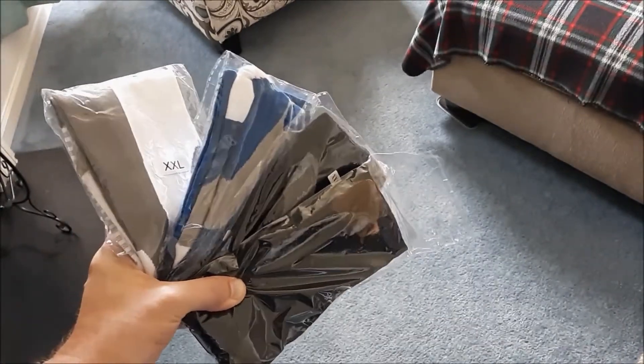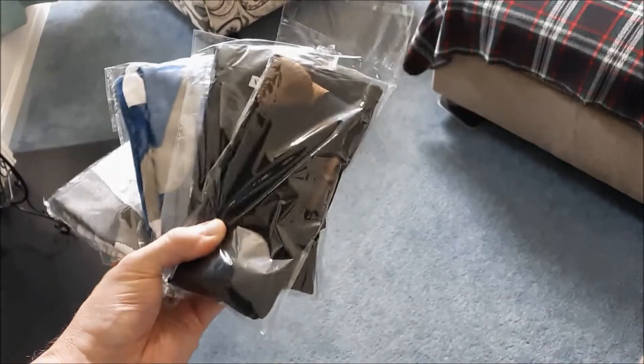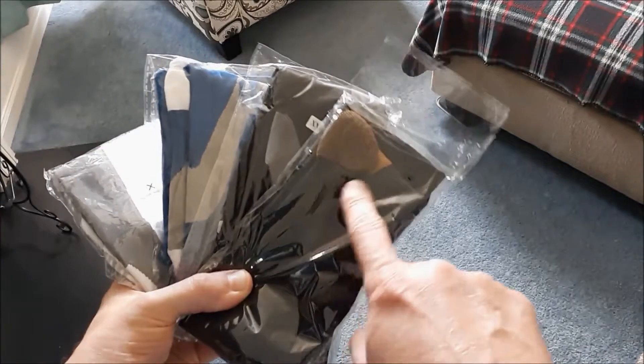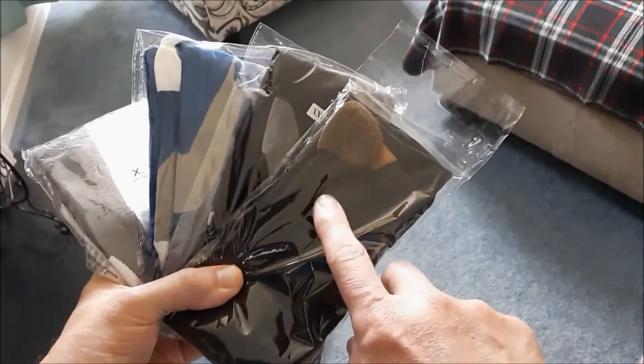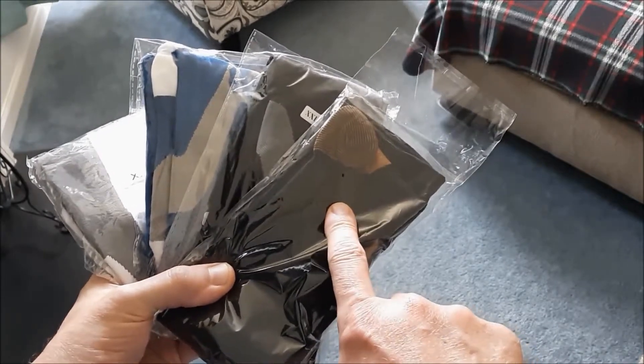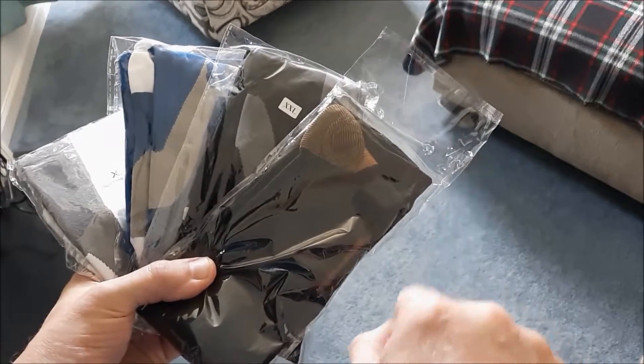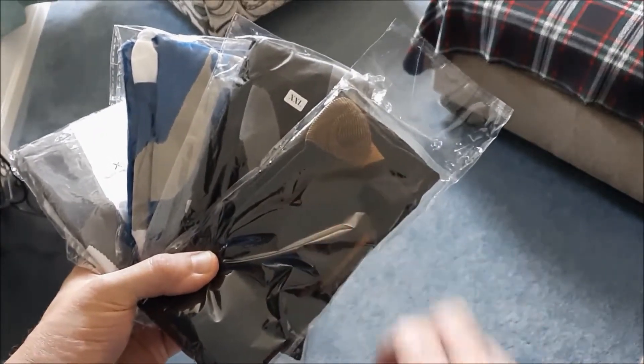They've got different colors — black and gray, blue and gray, white and gray, standard black with a copper toe. I actually wore these in my last video, my trampoline rebounder video. You can take a look at that — I'll put a link up top so you can see what they look like.